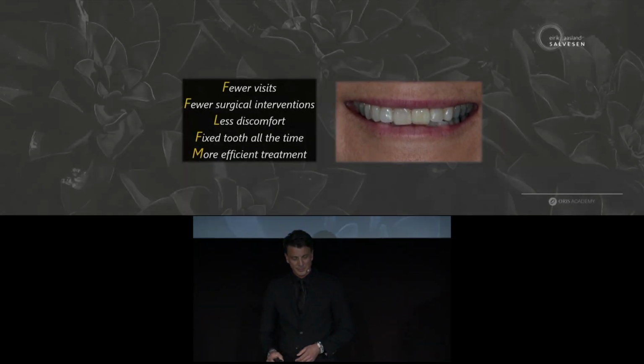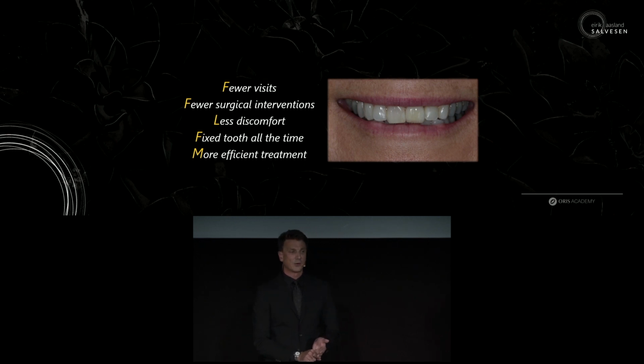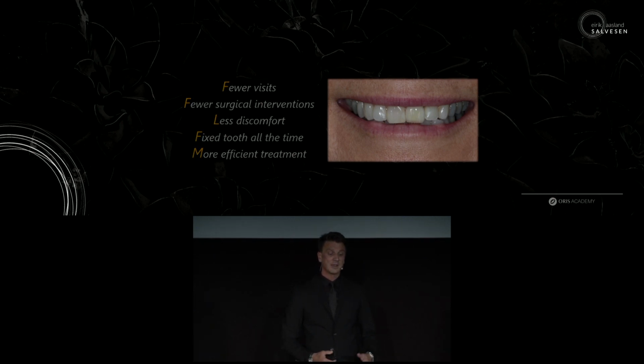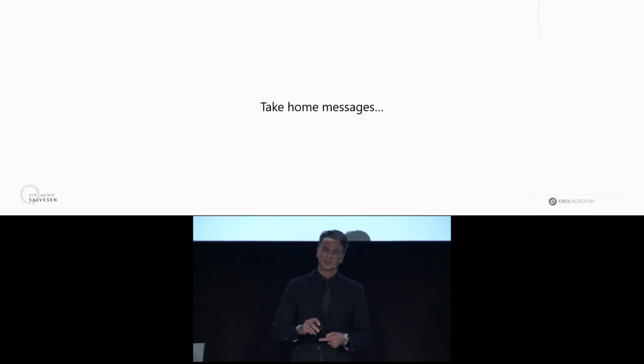So, what consequences does that have for my colleague? Well, it offers fewer visits. Okay, she's in my office every day, so that doesn't count. There are fewer surgical interventions, that counts. Less discomfort, that counts. Fixed tooth all the time, that counts. And more efficient treatment. And for me, as the employer of this colleague, it's less time away from work. Of course, it offers something. If I can provide minimal, the same result as I did when I did it conventionally, of course I should choose this. So, finishing off this one, I'd like to just give you some take-home messages.